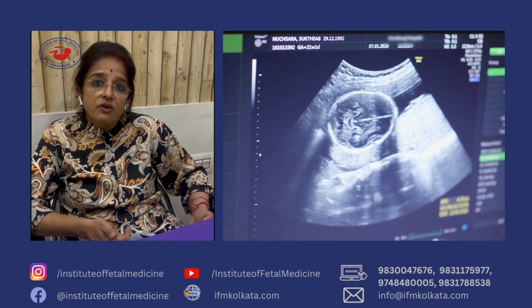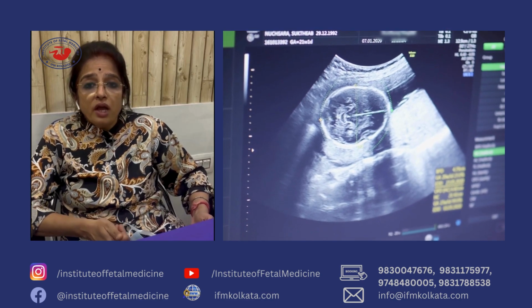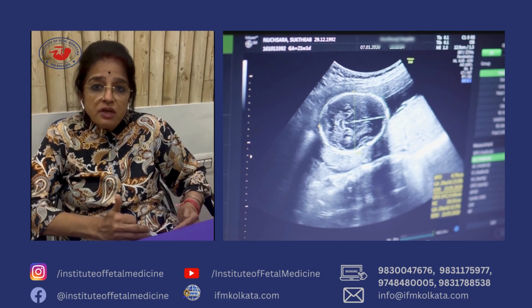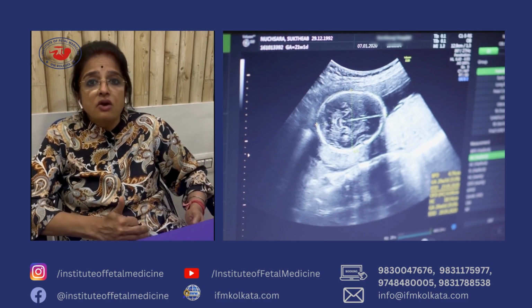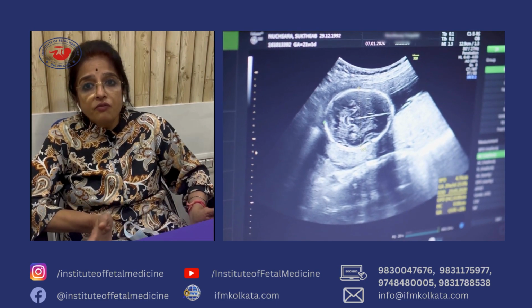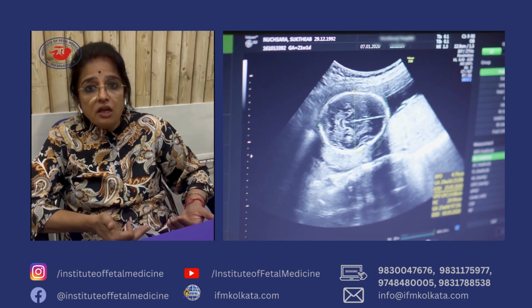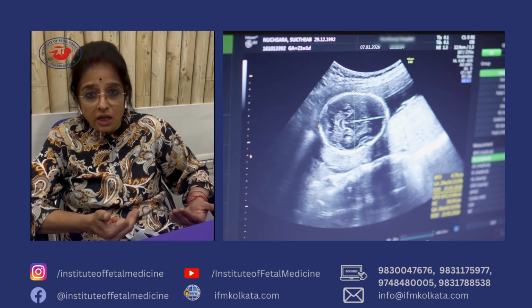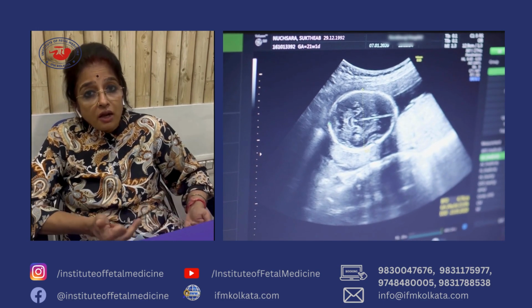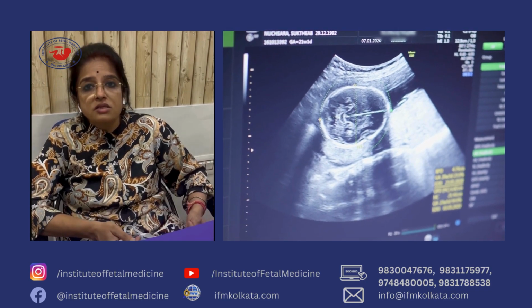Thirdly, transvaginal sonography is also indicated in infertility evaluation, where we have to see the fallopian tube, otherwise done via laparoscopy. TVS is a much simpler and easier alternative, where we can instill a little bit of saline into the uterine cavity and see whether the fluid is passing through the tube and having a spillage. That way we can avoid doing a more invasive laparoscopy involving hospitalization, anesthesia, etc. So we are now able to understand that TVS has its own indications in obstetric and gynecological practice.